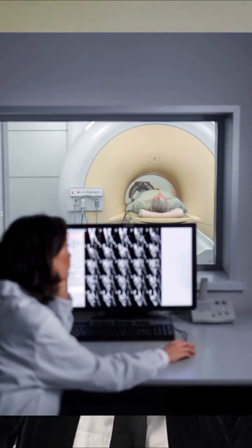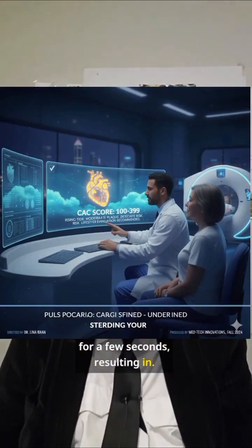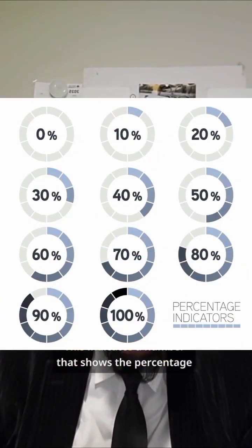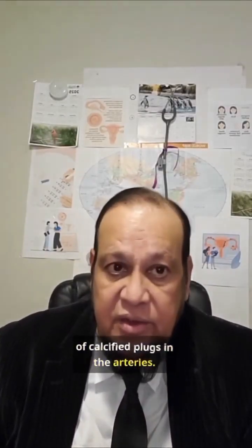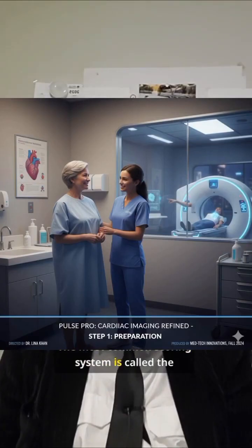The patient is asked to hold their breath. Results: the calcium score is a type of CT test that shows a calcium score. This means it is a number that indicates the percentage of calcified plaque present in the artery. It tells you exactly how much calcium is there. The most common scoring system is called the Agatston score.